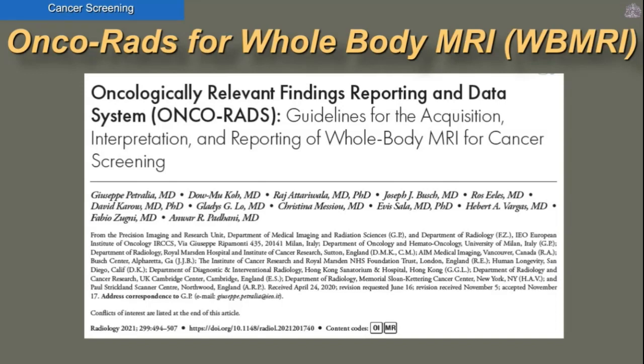screening reporting. And this has really evolved through the fact that incidental findings are so common, and we felt that it was really important to be able to communicate the relative risks of these findings back to the referring physicians so that appropriate action can be taken or not taken.